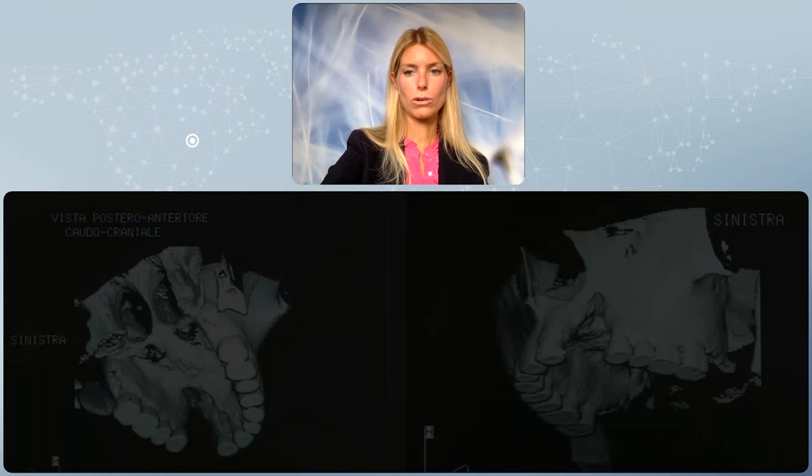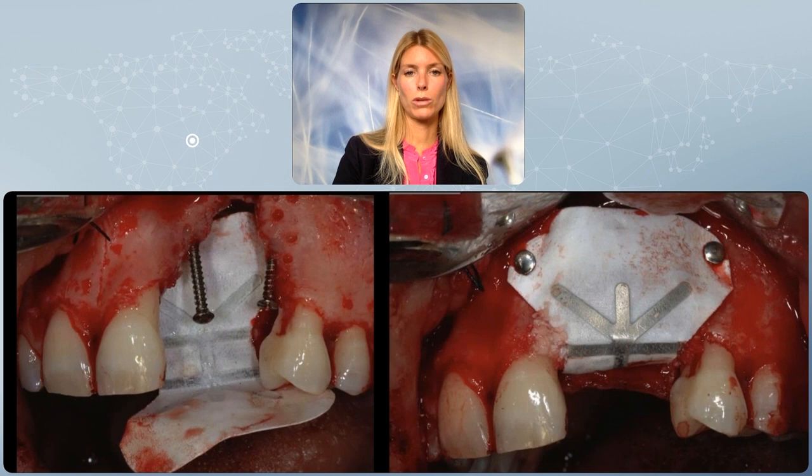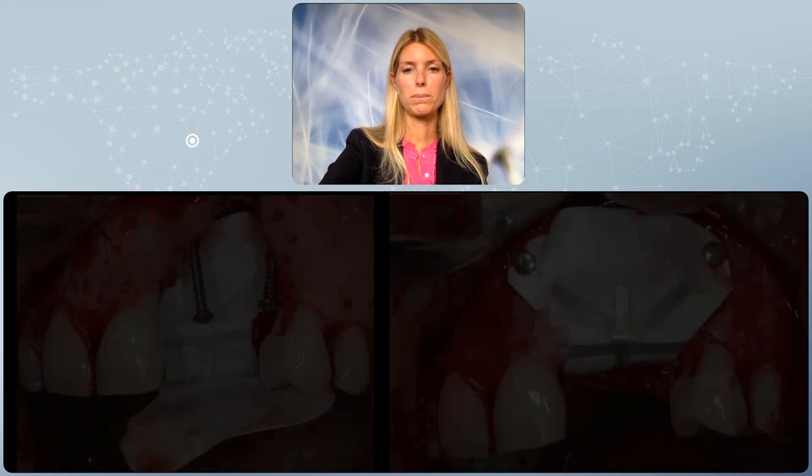You may notice the cortical perforations, you may notice the two tenting screws in an oblique manner to create and hold the space as well as possible, and the titanium reinforced PTFE barrier membrane, which is secured again on the palatal side first to allow for the barrier to be kept in place, and the buccal portion is then nicely tightened and secured by pins in this case. The graft material again was 50% autogenous bone and 50% xenograft particles.